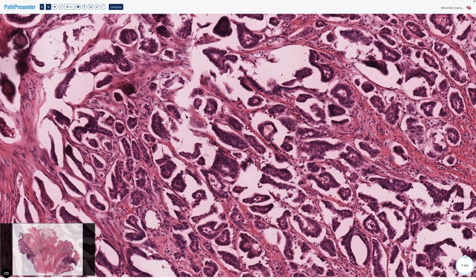And if we stain it with an epithelial stain like EMA, that usually stains the lumen, it now stains the outside. Because this is really the lumen, it starts to secrete, and that's why they've got a gap around them. So it's like an inside out sock with the vessel in the middle and these secreting into this space here. This is the micropapillary pattern, and this is the one that's most easy to recognize.